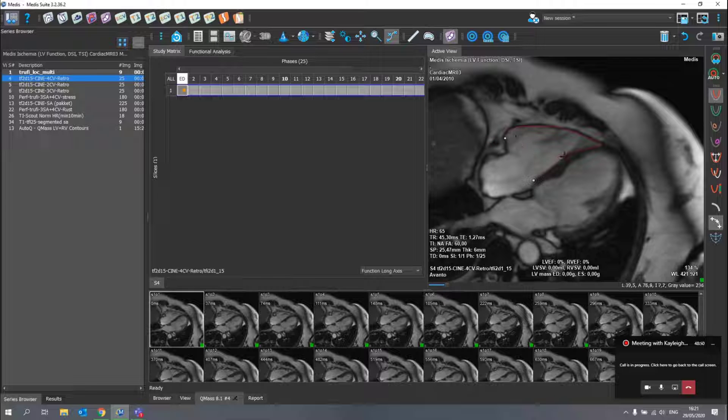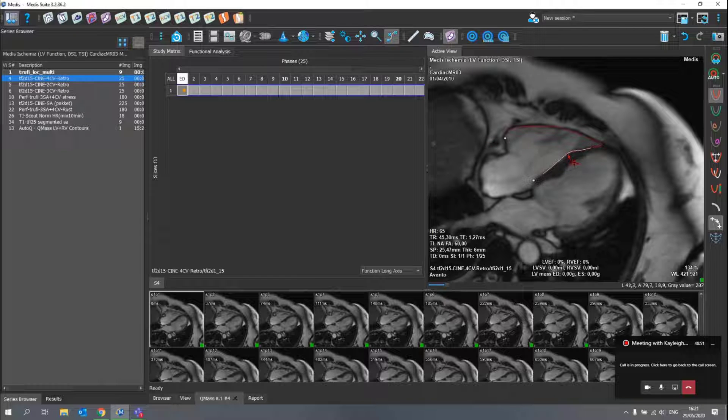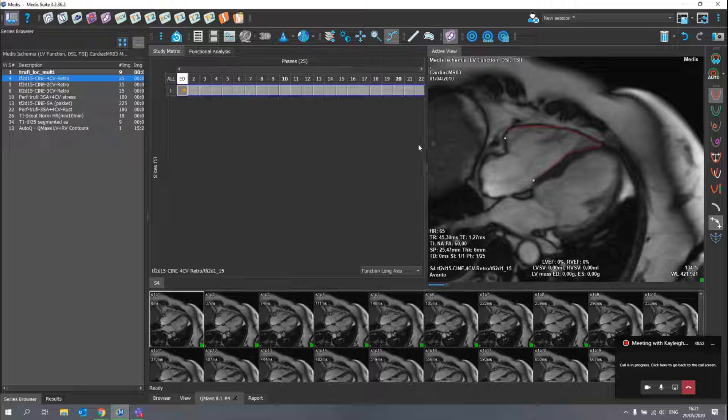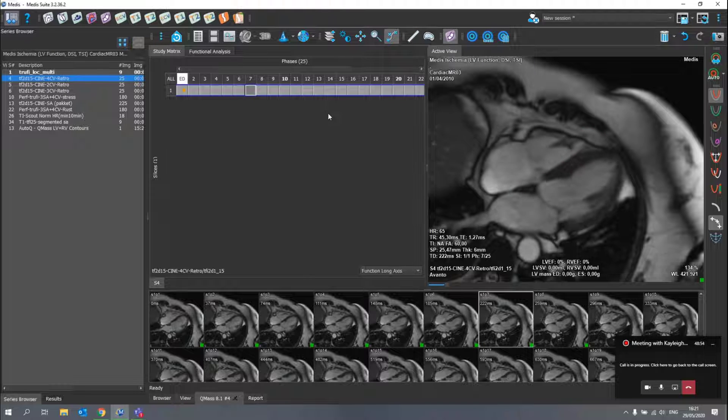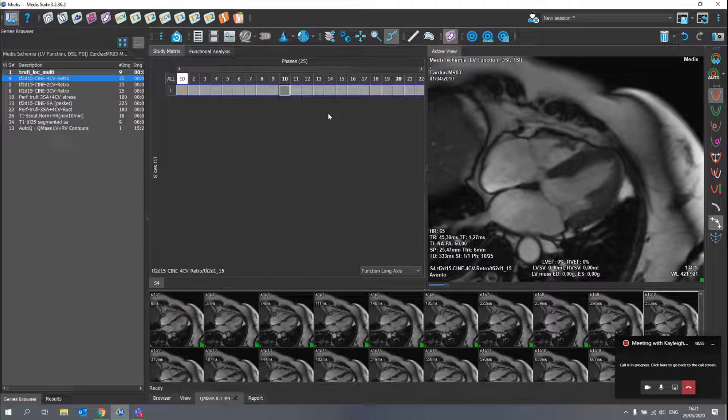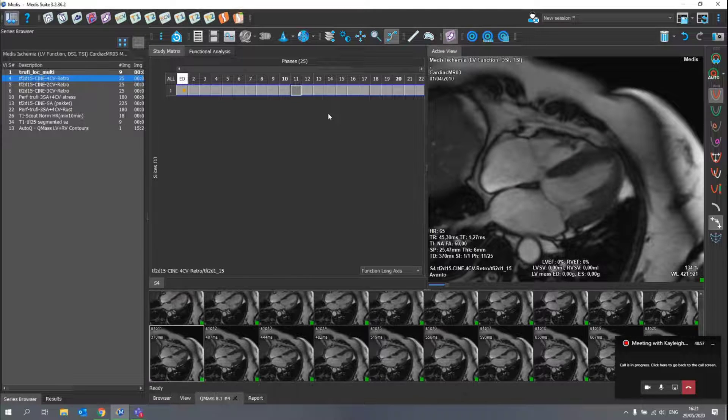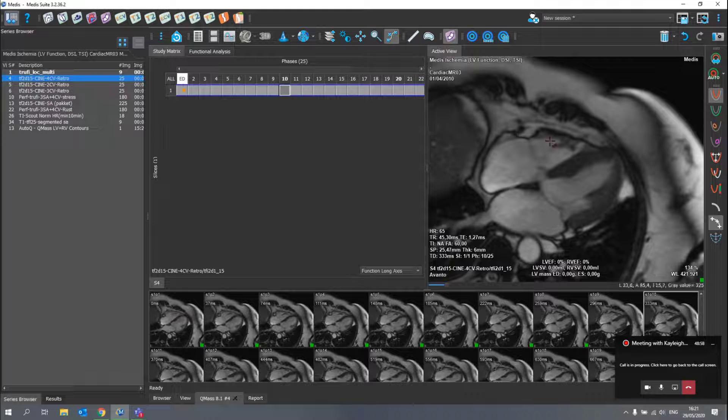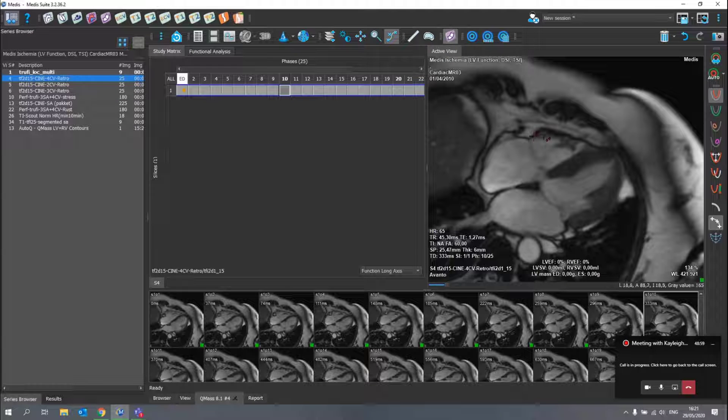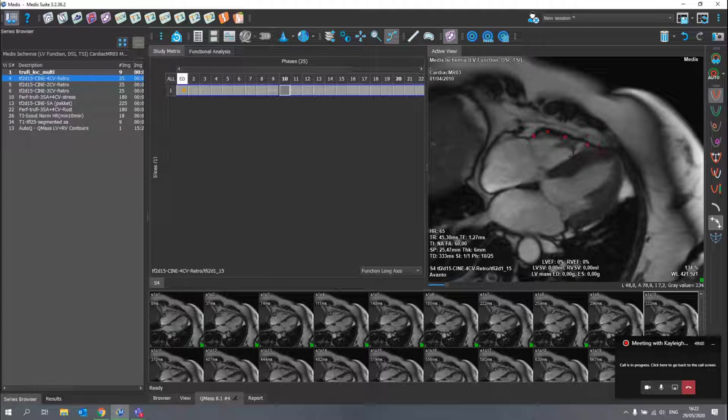With a few adjustments with my right mouse button and rubber banding tool, we go to the end systolic phase and we'll repeat the procedure to make the contours.